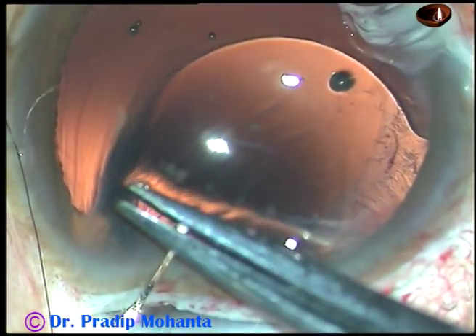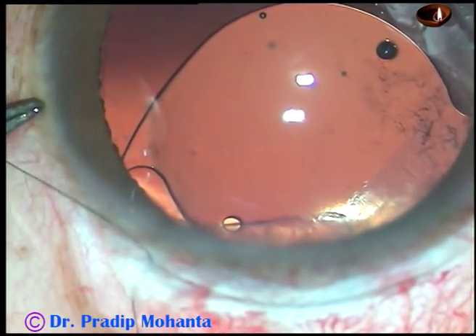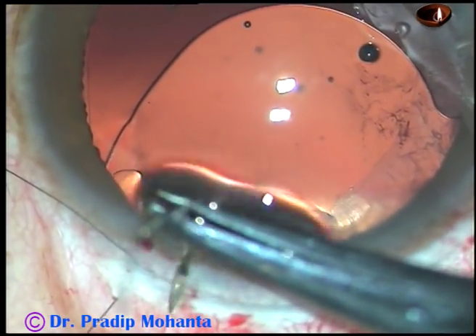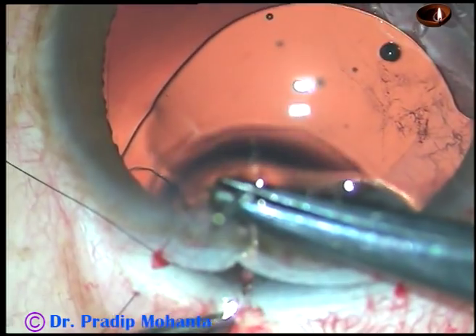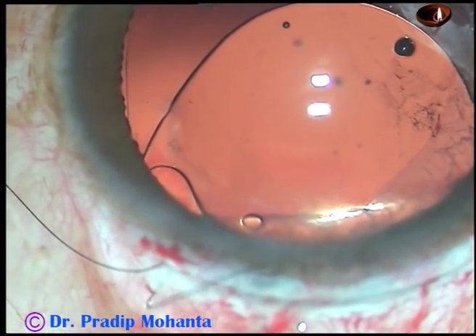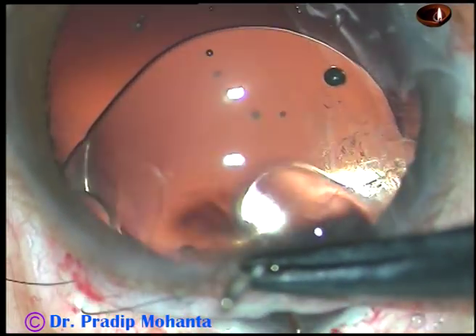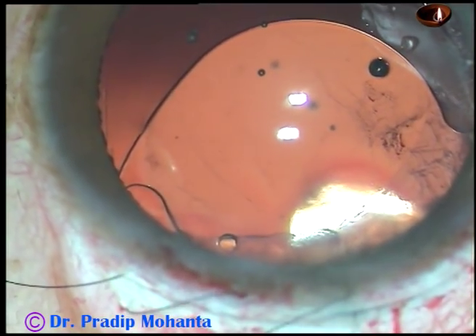Now see the suture — this is a continuous shoelace suture. First bite: going into the groove and the needle comes out on the scleral side. I am not going to edit this part of the surgery — I want to teach you this suturing technique. This is the second bite, and it includes both the anterior leaf and the posterior leaf. The first bite is only at the posterior leaf going into the groove. This is the third bite — it includes both the anterior leaf and the posterior leaf.